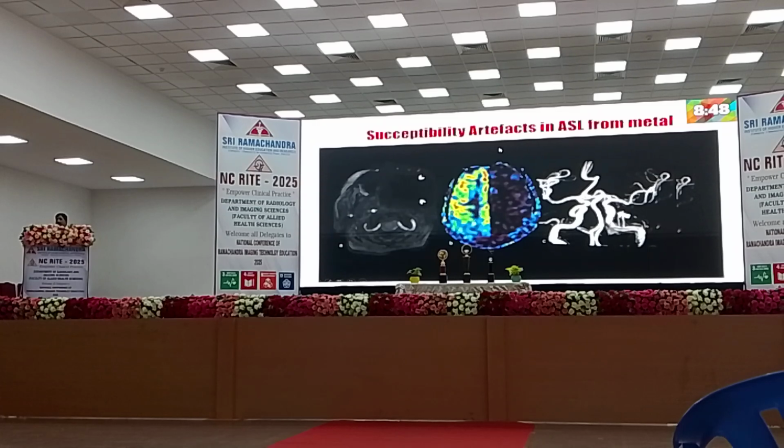Another important one: preparation is always very, very important. In patients with metal, you should not do ASL because it will cause a pitfall in reporting. You can see here the angio shows normal, but ASL shows hypoperfusion in half of the brain, though the patient is normal, because of the susceptibility artifact from the metal.